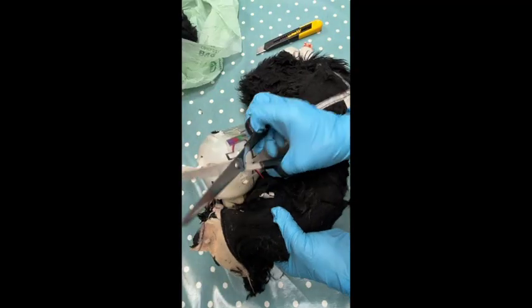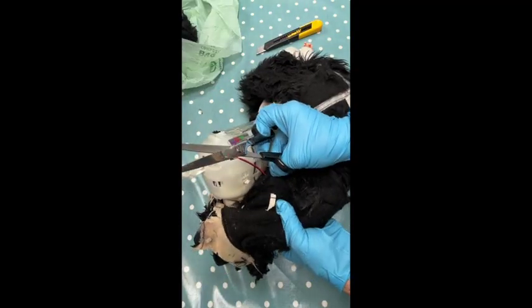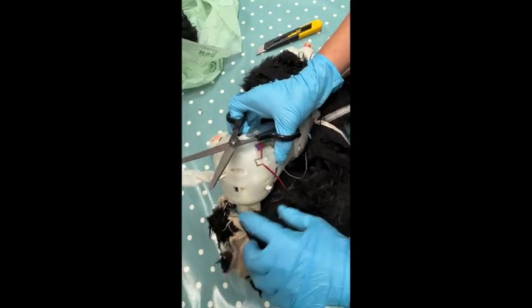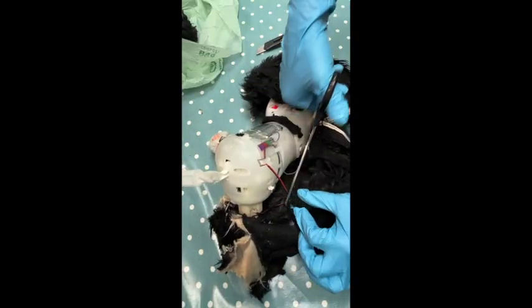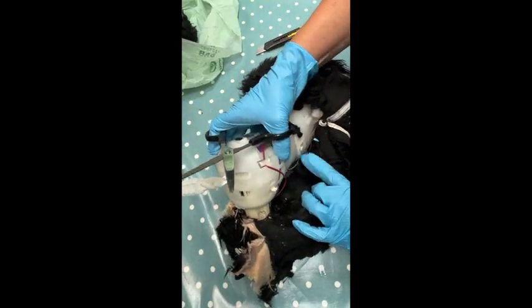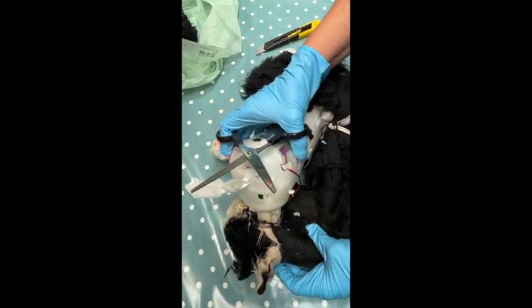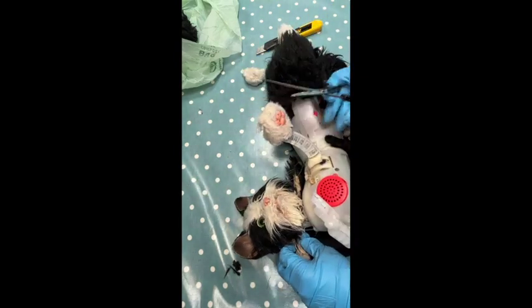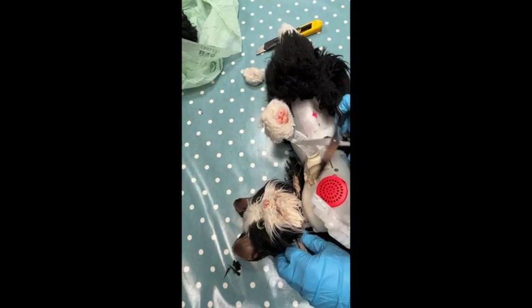There's an embedded sensor sewn into the fur. Oh no, I'm wrong. It's not sewn into the fur at all. So no sensors are actually in the fur at the moment. Just that one there.